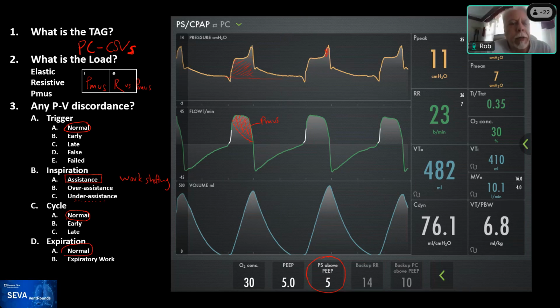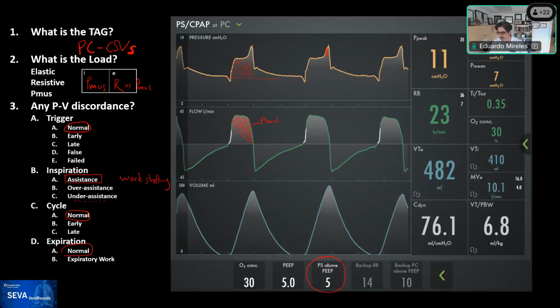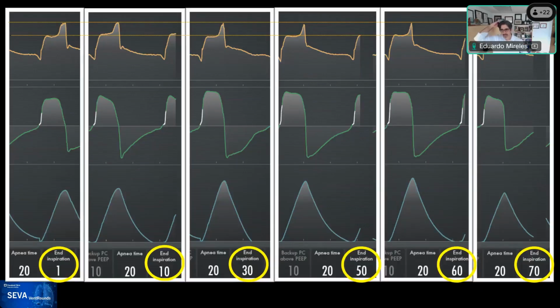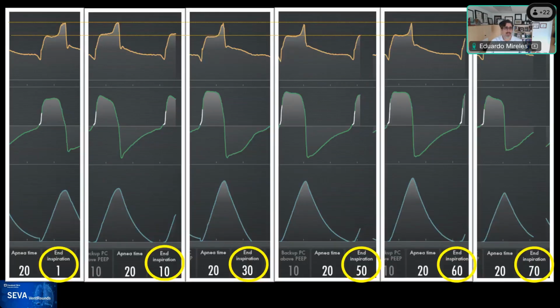So you saw how we were talking about the Pmus on the patient, and I did a POC on the patient. And you can see that the effort goes slow, and then it relaxes, and it goes down on the expiratory phase. On the inspiratory phase, it just suddenly relaxes. So I just wanted to show that. So now you have a visual on what's happening here and how it activates relatively slowly and then relaxes.